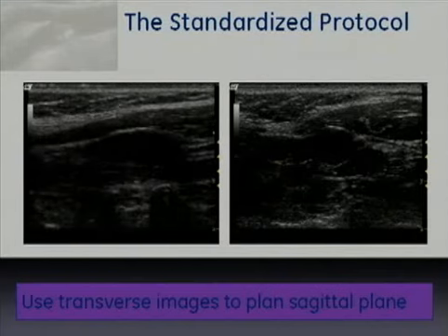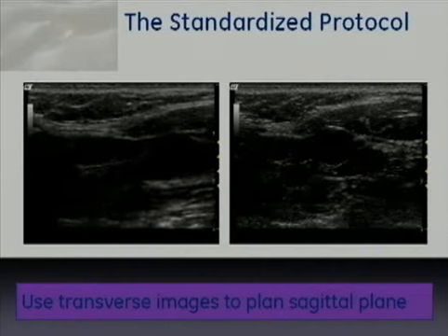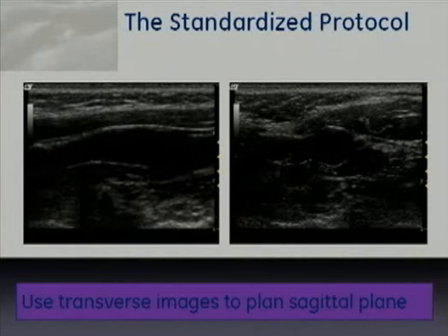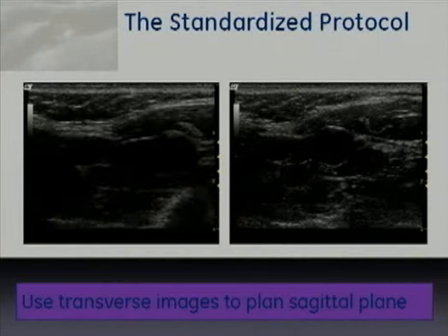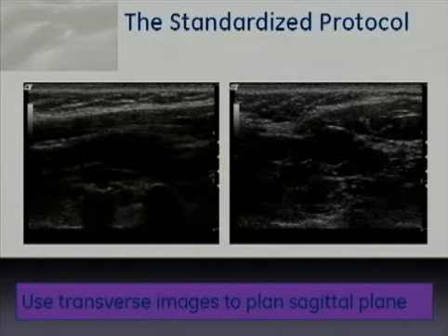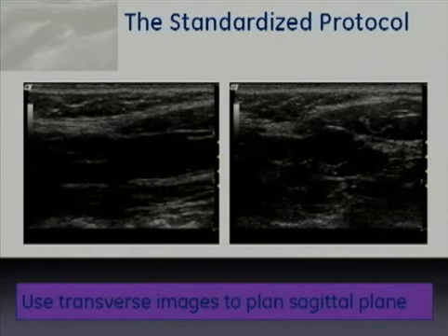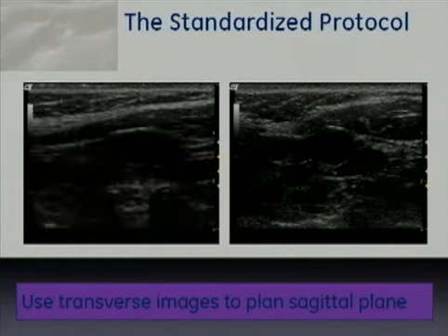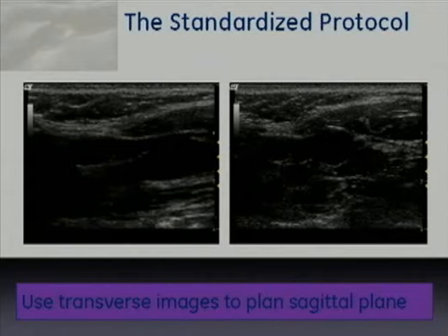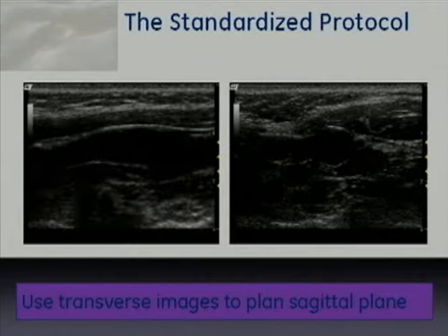This isn't a large motion, it's a very tiny motion because these vessels are actually quite close together, just going back and forth, and then making sure that each one of them ties back to the common carotid artery. Why is this important? Because it ensures that we're looking at two different vessels rather than one vessel from two different views, which is a mistake we might make if we pick up the probe and simply move it between the vessels. It's easy to actually look at the same vessel and actually mislabel it as two different vessels. So this will keep you from making that mistake.